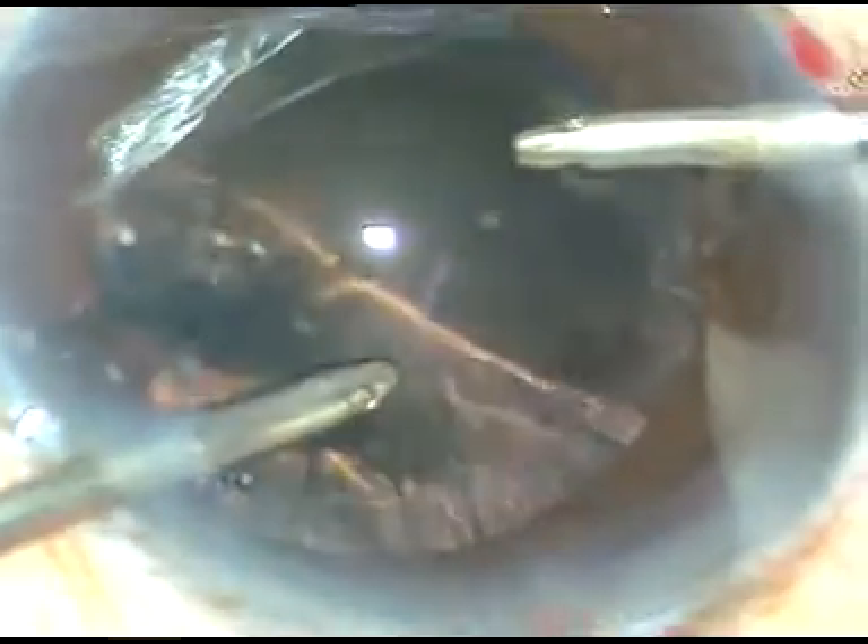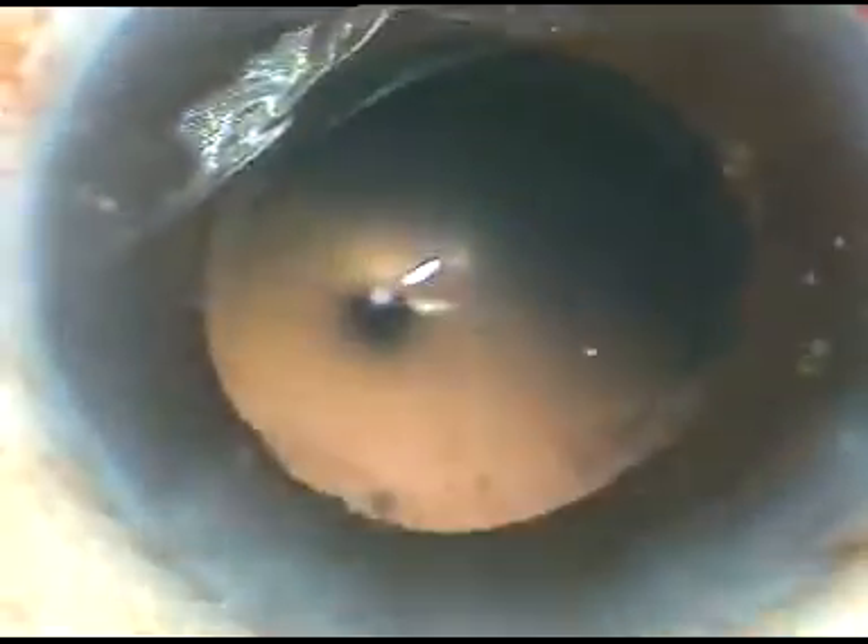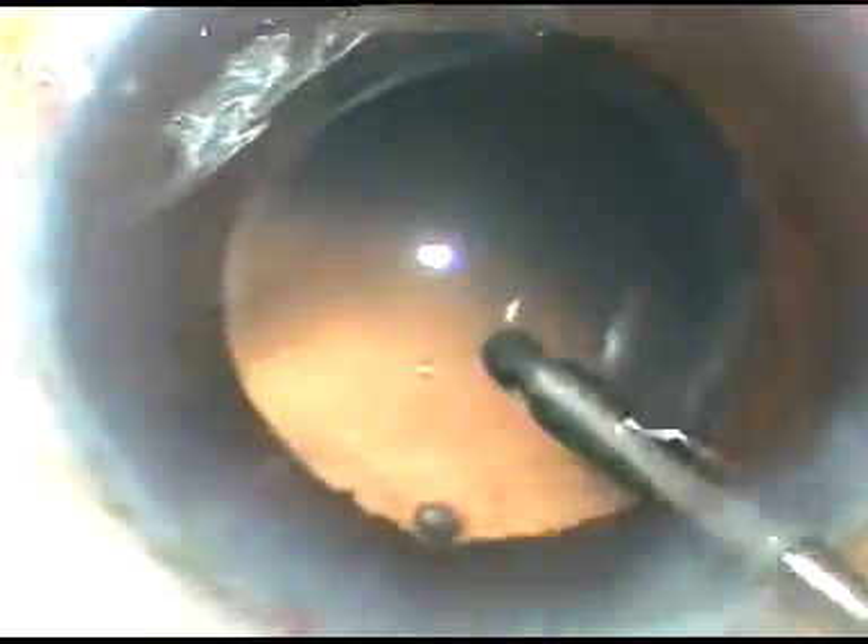The irrigation is from the right side port and the aspiration is through the left side port, and most of the cortical lens matter has been removed. Now irrigation is from the right side and aspiration from the left side port. A lot of cells are sticking to the posterior capsule. The jet of fluid from the irrigating probe is used to dislodge these cells and polish the capsule — this is fluidic capsule polishing.